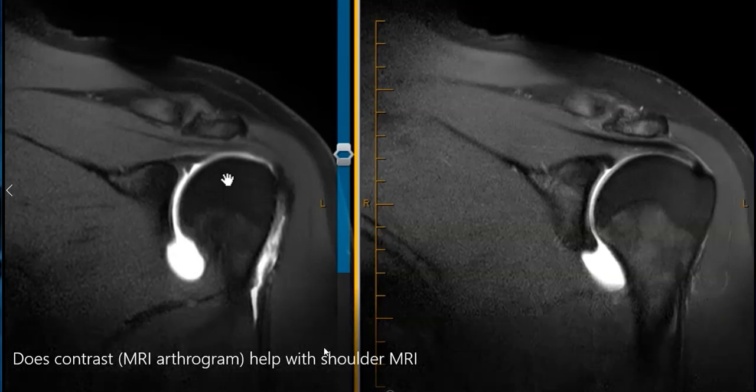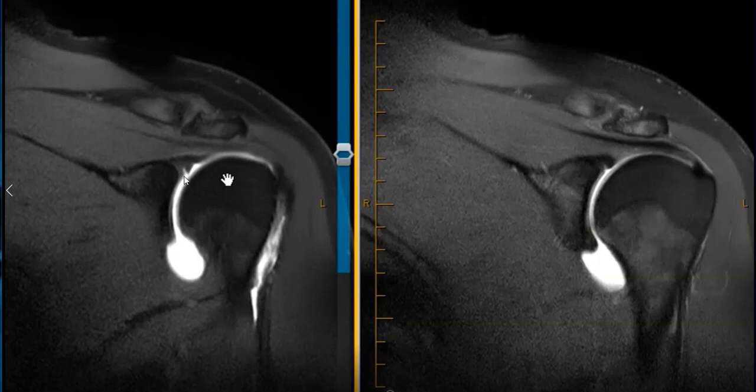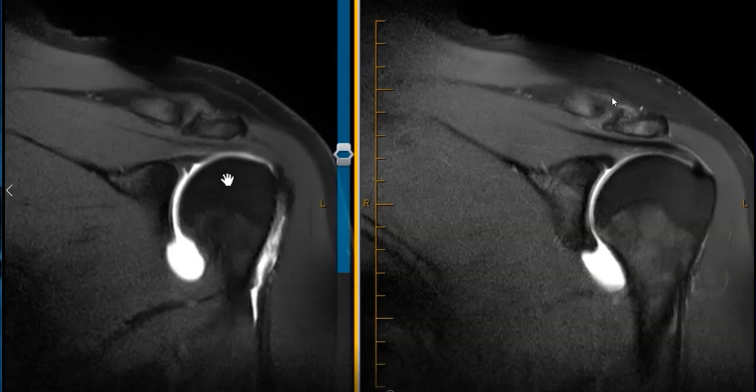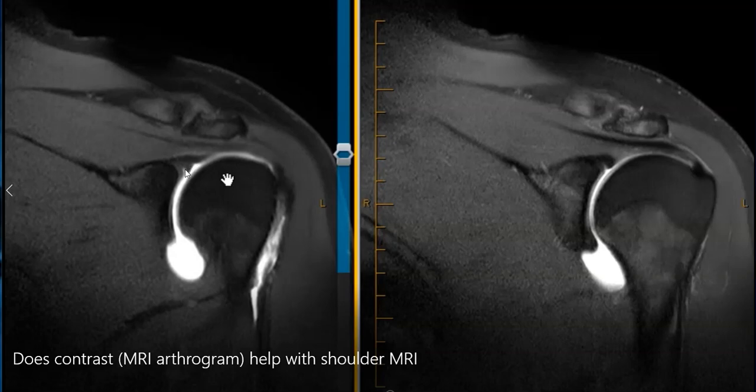Originally I thought this was probably a labral tear, but in retrospect this is more likely a developmental defect, because of how clearly defined it is — very sharply defined and smooth — and it hugs this little articular cartilage here. So it's probably just a developmental defect rather than a labral tear. Now the doctor may still want to go in and look at that, but they'll have a better roadmap with these images. This patient also had some arthritis of their AC joint — this is the clavicle and acromion — they had AC degenerative arthropathy, which may be contributing to some of the pain, especially if this is just a developmental defect.